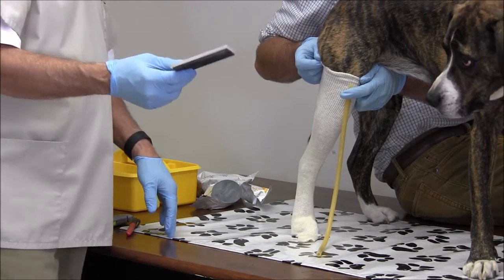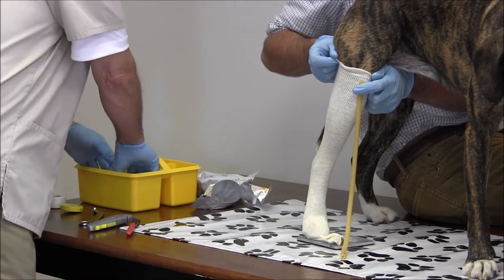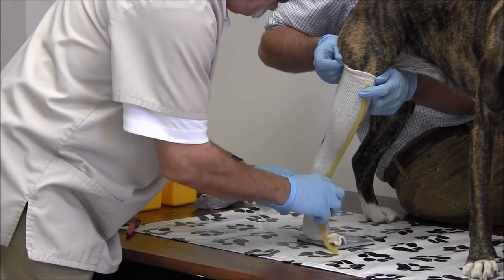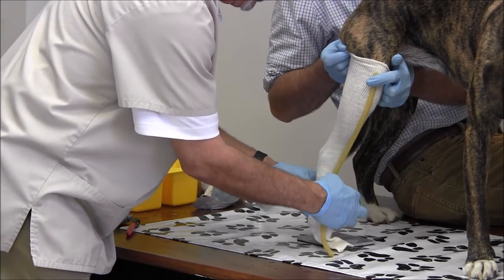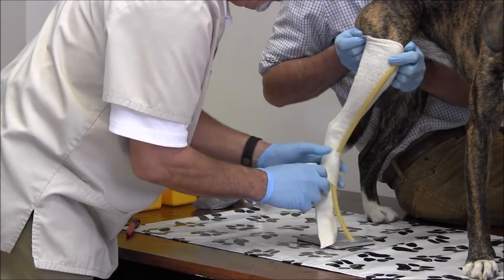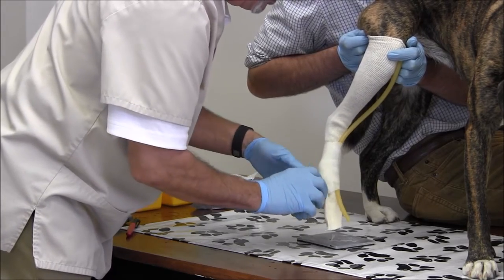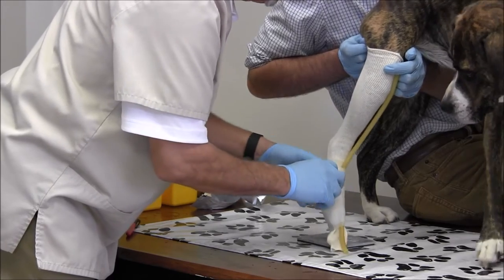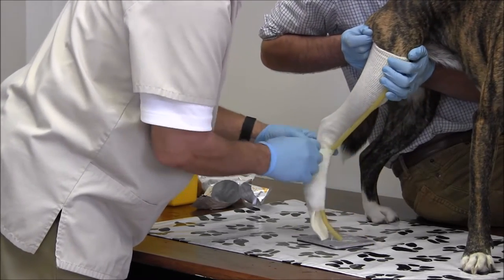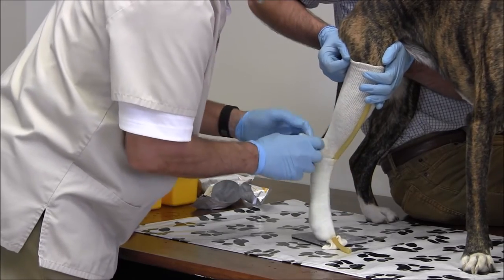We should start by putting a little piece of plastic, foam, or something underneath the paw. The fiberglass has been in there ten seconds — I've squeezed it out three times and I'm going to start wrapping the dog's leg, wrapping around away from us. We want to make sure the tube is going in the right direction, towards the front. When we wrap around the paw, we don't want to wrap too snugly or too tight — we want to get the actual circumference and shape of the paw. We only need about three wraps on the dog's leg; anything more and the cast will be difficult to get off.